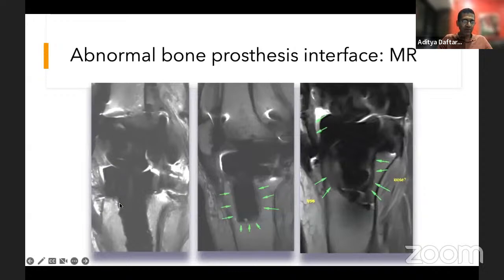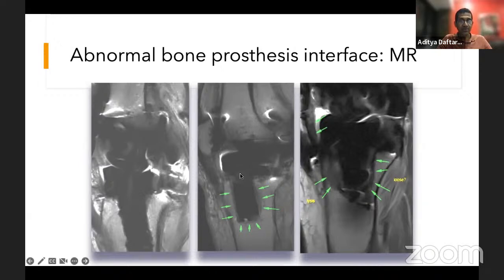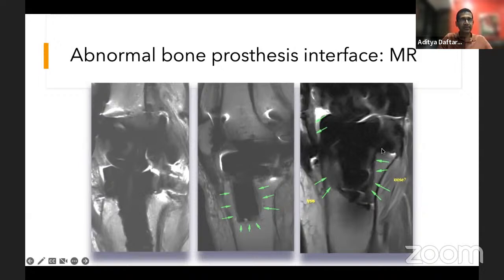On MRI, you can see the cement and bone are almost flush — normal. But a slender gray area surrounding the entire course of the tibial stem is membrane formation or poor osteointegration — this prosthesis is actually loose. In another example, big chunks of scalloped bone indicate osteolysis along almost the entire tibial stem — this one is likely loose as well.